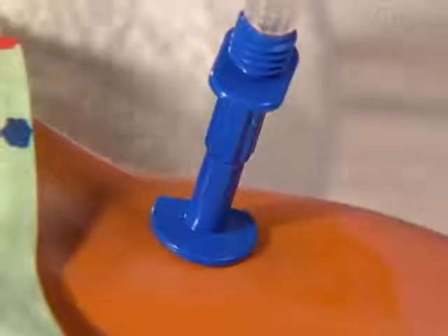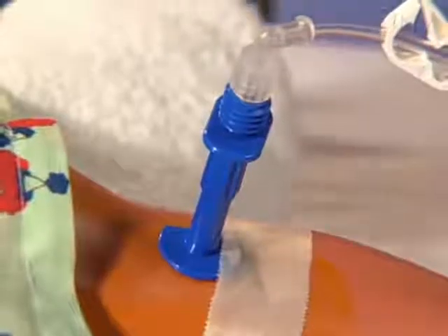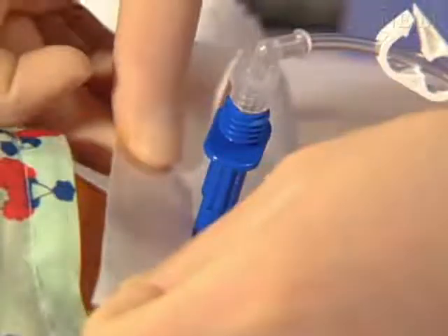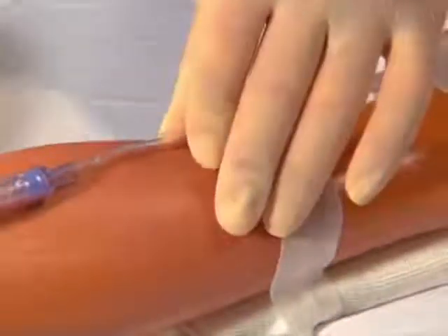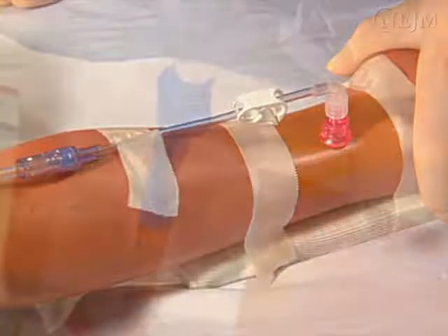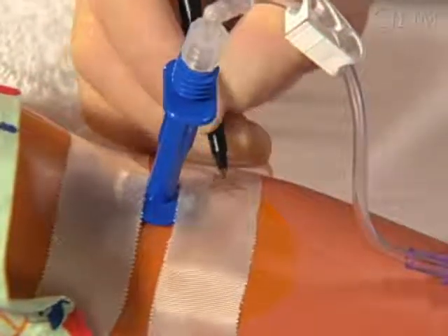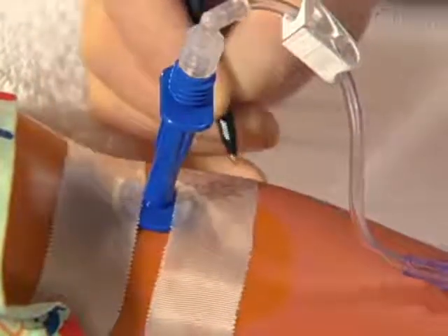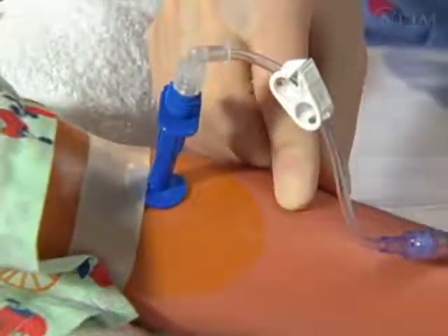You may place tape or sterile gauze around the insertion site. However, avoid the use of dressings that will prevent you from monitoring for infiltration, infection, or limb swelling. Use an arm board to provide additional stabilization. Secure the IV tubing away from the insertion site to avoid inadvertent movement of the catheter. Record the time and date of placement near the insertion site or on an identifying wristband. The intraosseous catheter should be removed as soon as more definitive access is obtained.